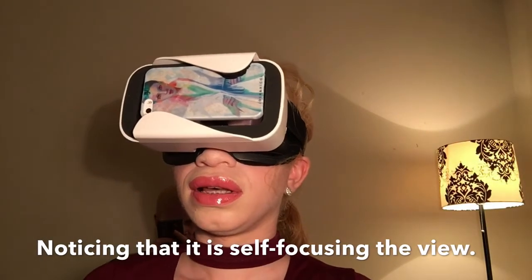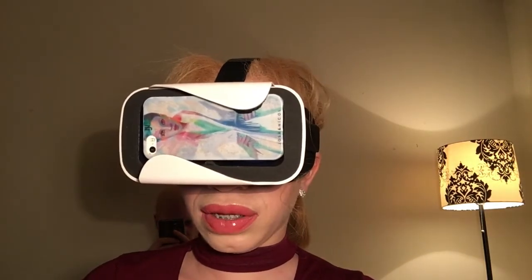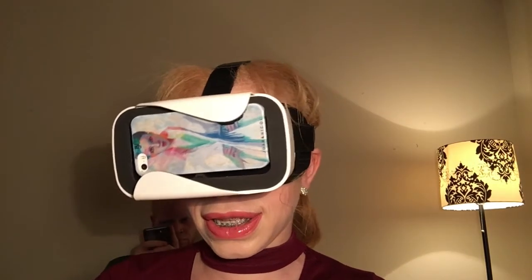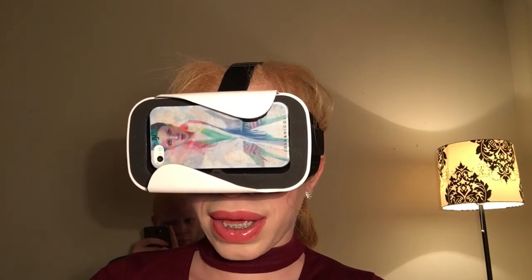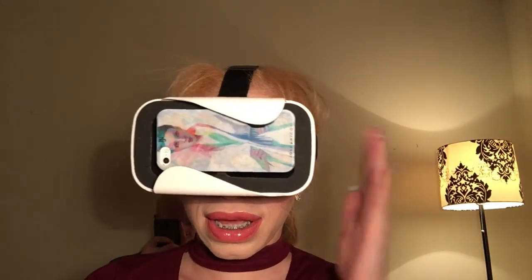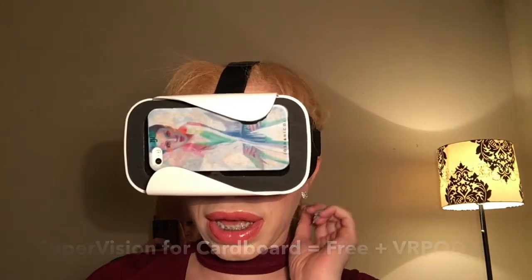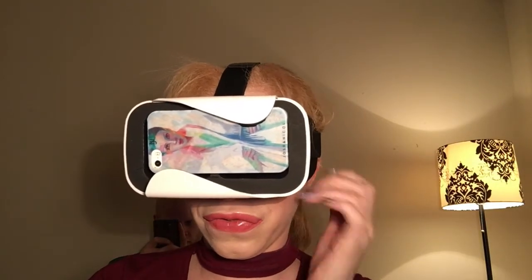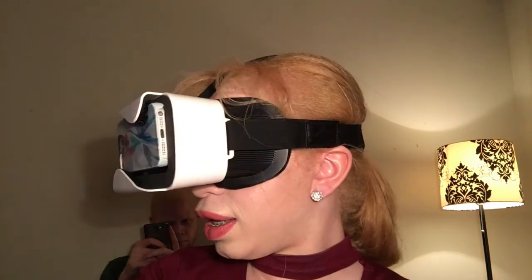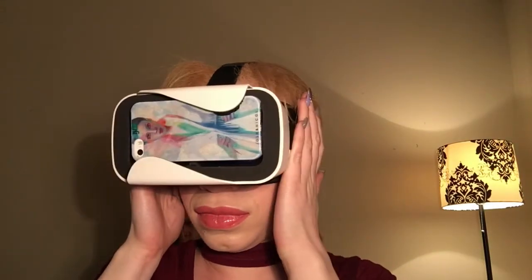This is just an alternative for adaptive technology — if you don't have access to a fancy CCTV, this is something basic. Supervision is free on the Apple Store, and like I said the headset is only five dollars. I think it fits most phone sizes — four to five inches — but I'll put the specifications below in my description box.